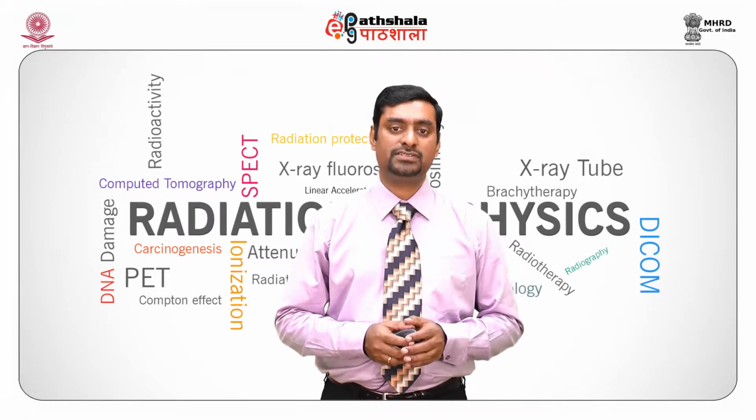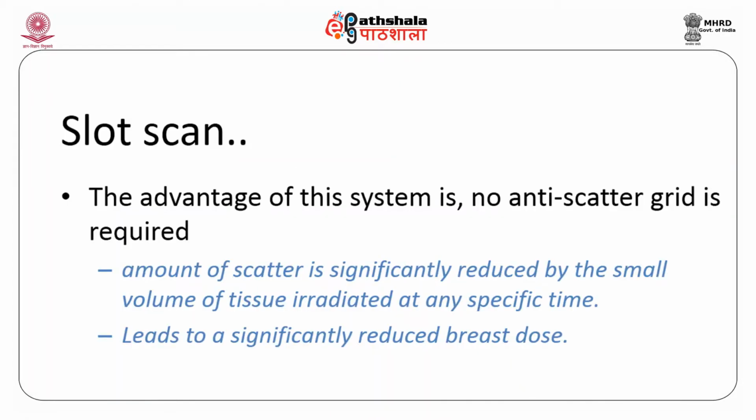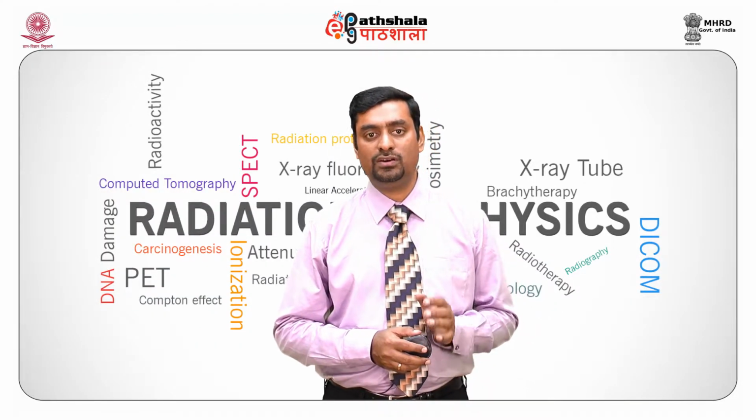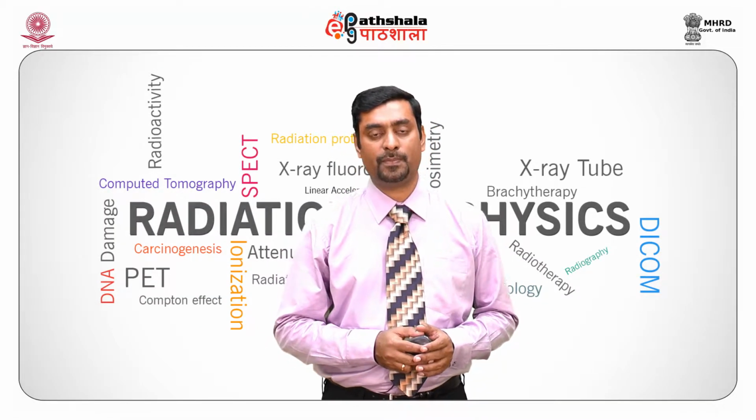The advantage of the system is there is no anti-scatter grid for this machine. The amount of scatter is significantly reduced by the small volume of tissue irradiated at a specific time, because the slit that is present in the collimation assembly as well as on the detector assembly is small, and it leads to reduced scatter. It also leads to a significantly reduced radiation dose to the breast. However, this requires high tube loading.